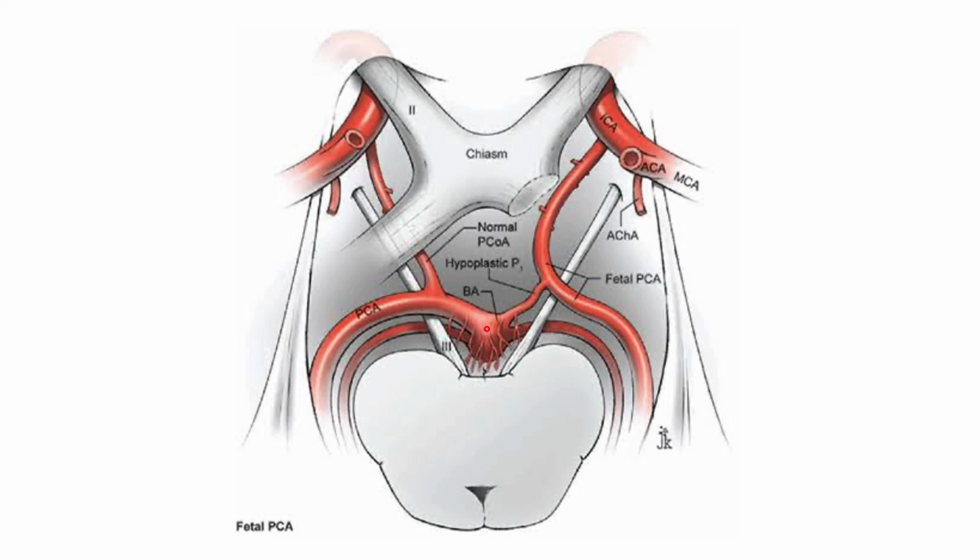But if you look on the left side of the basilar artery, the posterior cerebral artery here is hypoplastic. This P1 segment is hypoplastic. And in actual fact, this PCA is coming from the internal carotid artery, and it's a much larger dominant PCOM if you compare it to the right side. So here this is called a fetal PCA, because this posterior communicating artery is the one actually supplying this PCA from the internal carotid artery. So this PCA is not actually being supplied from the basilar.